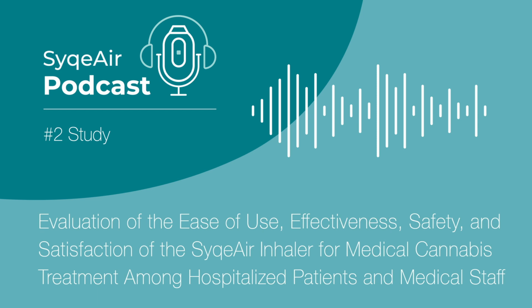Right. So many patients rely on medical cannabis to manage chronic conditions like pain, spasticity, nausea. But obviously smoking isn't an option in the hospital. And even traditional inhalers can be inconsistent when it comes to dosage. And that inconsistency poses a huge challenge for both patients and doctors.